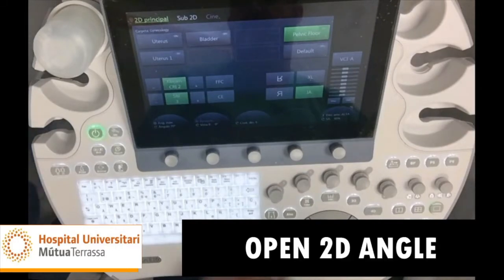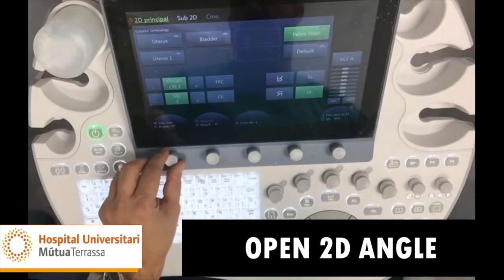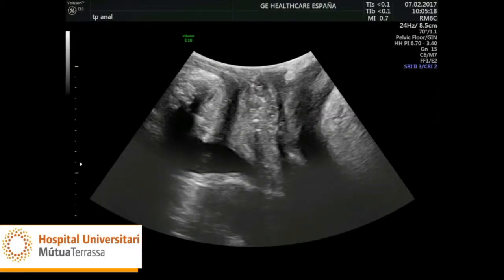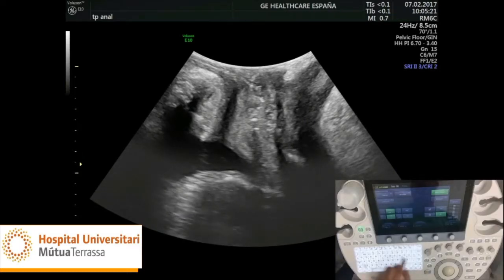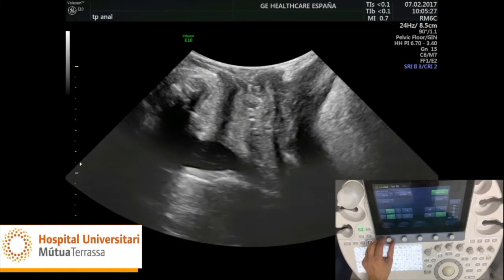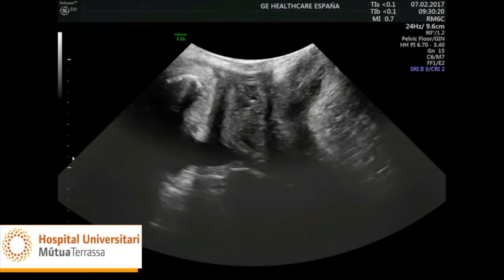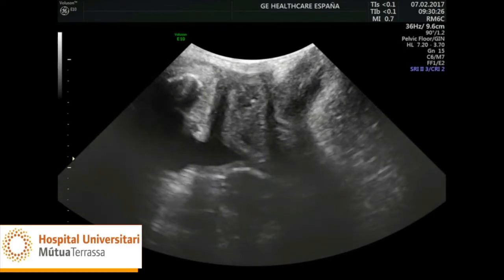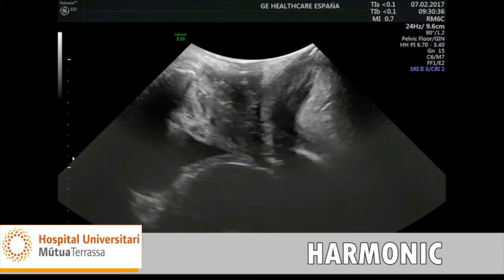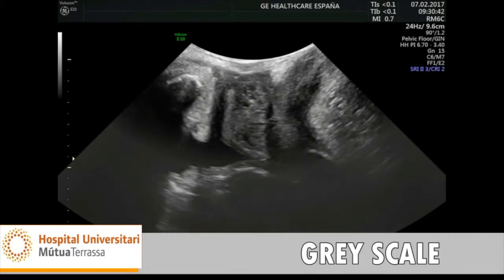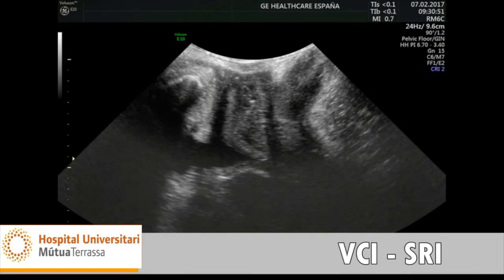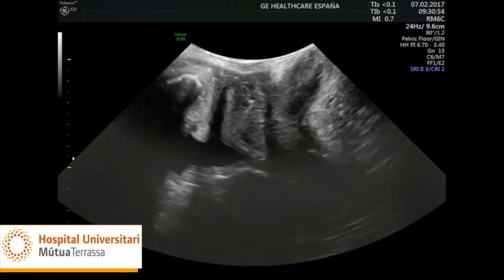To ensure that the image spans from the pubes to levator ani, and bearing in mind that the hiatus will increase in size when the Valsalva manoeuvre is performed, the study should be started by opening the angle to the maximum possible on the two-dimensional transducer. We aim to get the best image possible using frequency harmonics and grayscale gain, and applying VCI and SRI if the machine software allows this. It is important to remember that if we have poor 2D imaging, the 3D imaging will also be poor.